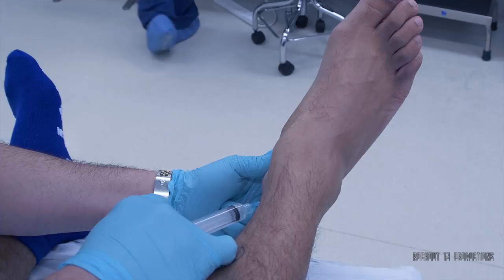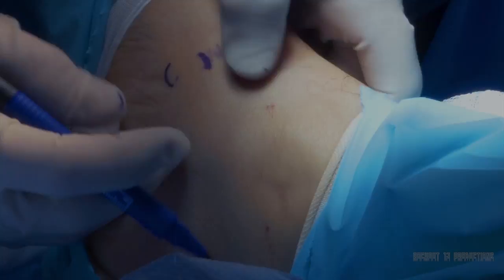For this procedure, the patient is placed in the supine position. A thigh tourniquet is applied to assist with hemostasis. Local anesthetic is often used to augment general sedation. The foot is prepped and draped in the usual sterile manner using aseptic technique. The leg is elevated for three minutes and the thigh tourniquet inflated.